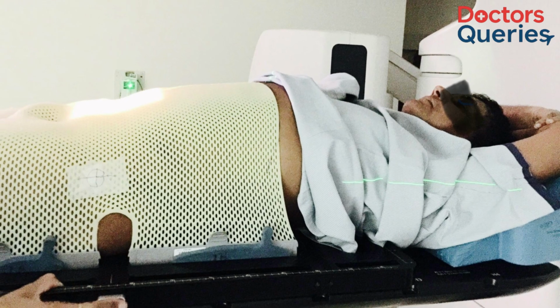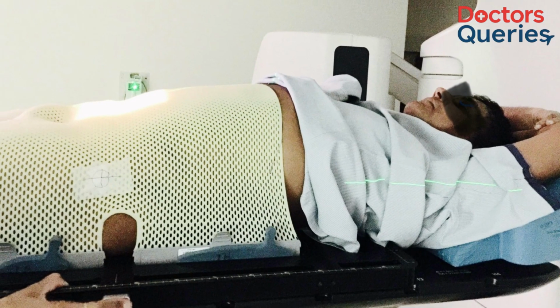The patient is made to lie on the simulator machine wearing a mask. What is a mask? A mask or a cast is made proportionate to the patient's body, the part where we want to treat the patient. Like if the patient is being treated for a pelvic cancer, then the cast is made of the pelvis. If the treatment is for the head and neck area, the mask is made for the head and neck. This mask the patient wears during the treatment.